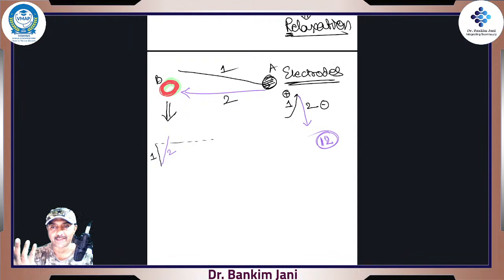So both 1 and 2 are depolarization waves. Well, that's what I'm telling. See, depolarization or repolarization only applies when we talk about that particular tissue, right? Over here, as you very rightly said, it is a positive deflection or a negative deflection. With respect to electrode B, this is a negative deflection. It is going down. And with perspective to electrode A, this was a positive deflection. So which one is good? Well, both are good, right?